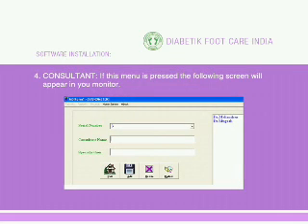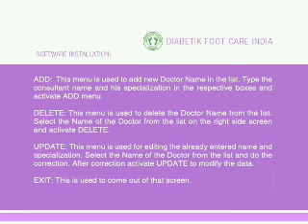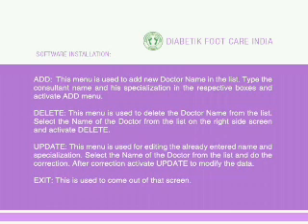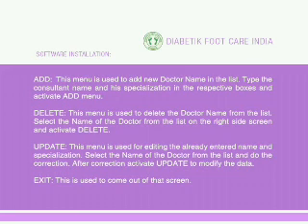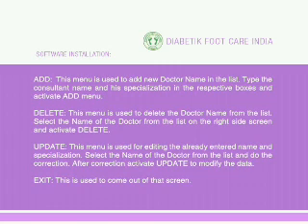Consultant: If this menu is pressed, the following screen will appear. Add — this menu is used to add a new doctor name to the list. Type the consultant name and specialization in the respective boxes and activate Add. Delete — this menu is used to delete a doctor name from the list; select the name from the right side and activate Delete. Update — this menu is used for editing an already entered name and specialization.